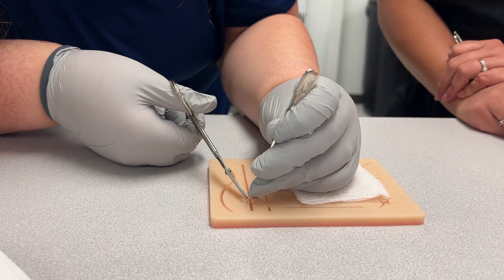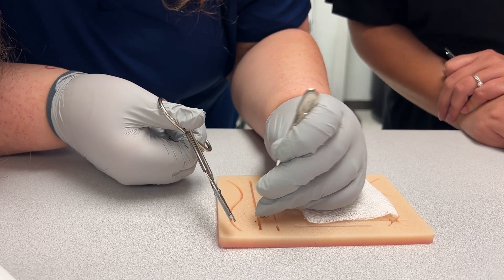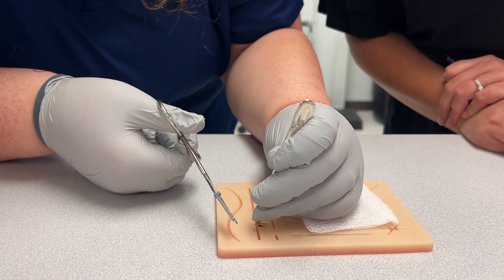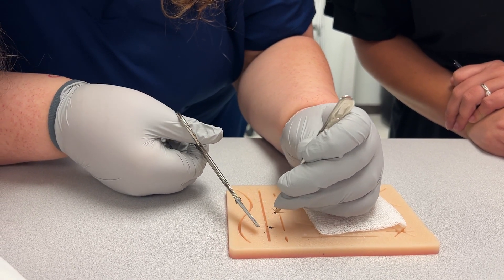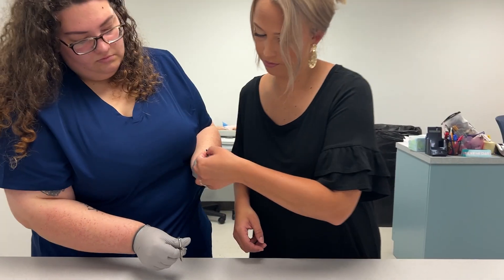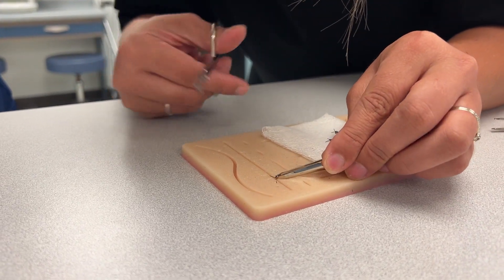It's harder than it looks sometimes — it's hard to get up under there. One broke, but that's okay; it went through the skin on the fake skin, that's okay. There you go, perfect. Let me see if I can get this last one — it came through, see?